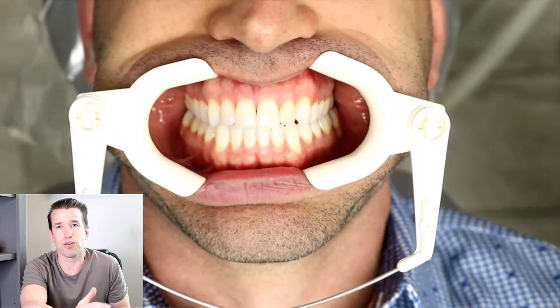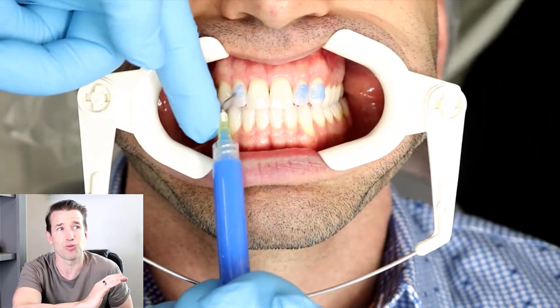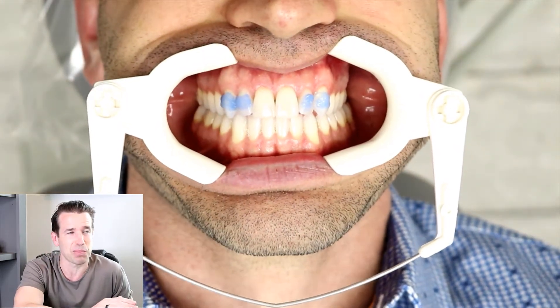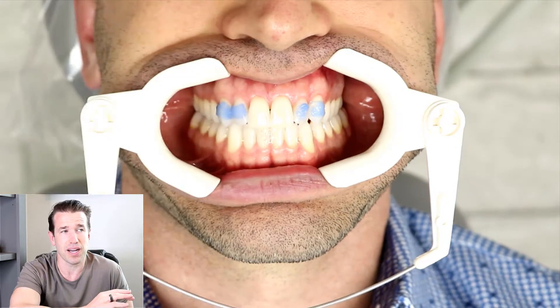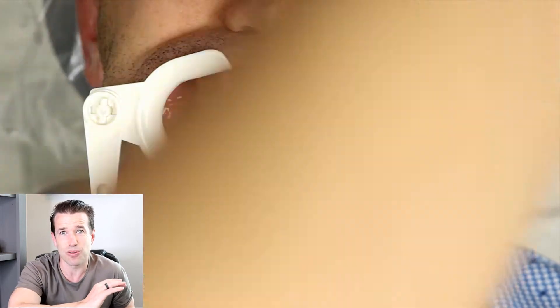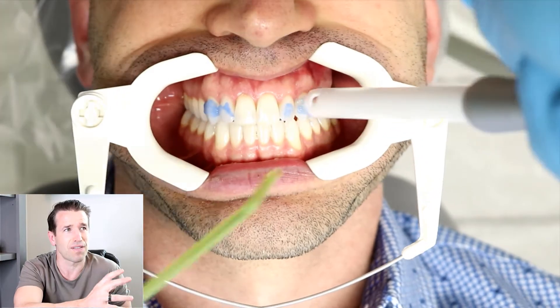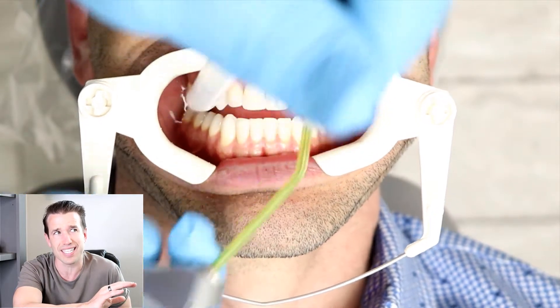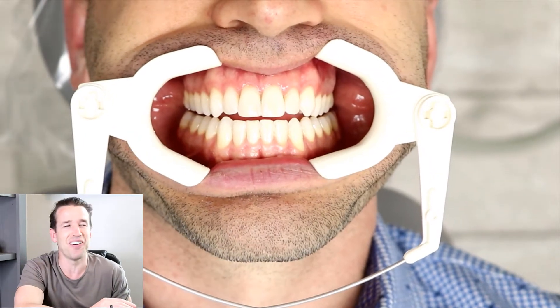All right guys, so let me walk you through this. I'm getting the attachments on right now. I am getting the etch put on the teeth. You're going to recognize that this is very similar to when you get braces on — basically the exact same process, but instead of braces it's attachments. This is Sharon who's helping me out here. She is putting on this blue etch that helps us see exactly where the etch is. We keep it on there for maybe 20 or 30 seconds, just to get this kind of frosty white appearance. She's going to take off all this etch with a high suction vacuum — you don't want to get this etch on the gums or in the mouth or in the back of the throat.